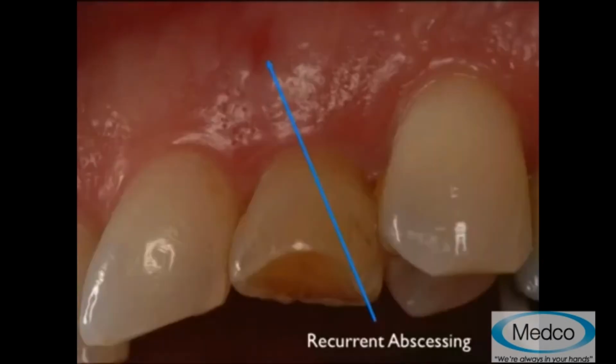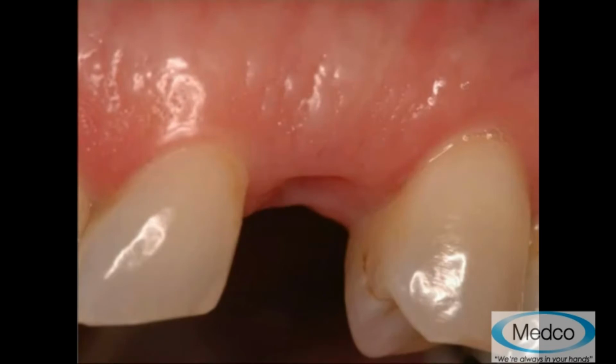So here's this patient who is constantly traveling, a 53-year-old in the computer industry, constantly traveling outside the United States, who has a recurrent abscess on a primary tooth. We extract it, and in the area, we placed a little bit of a collagen sponge and allowed it to heal.